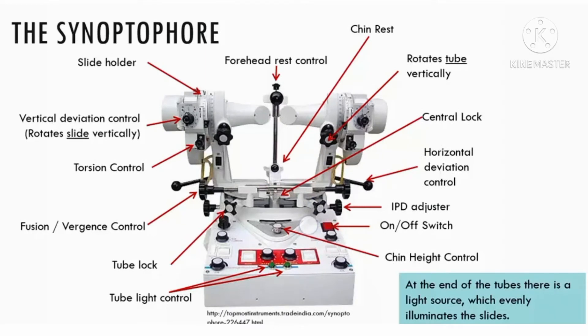Tube light control: for the patient to see the slides visible, we turn on these tubes' light with this tube light control. This tube light control also allows the patient to fix with only one eye. Left slide holder ki slide dikhane ke liye hum left tube light ko on karenge.